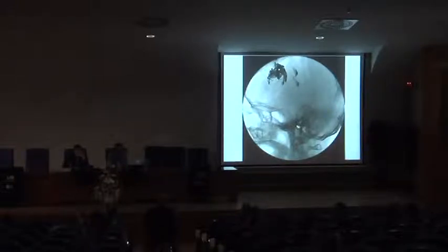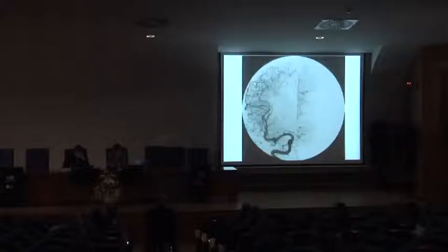Second, quick change of hemodynamics. And third, we push liquid polymer into a possibly ruptured aneurysm during injection of liquid polymer. This is a happy end. You can see the malformation is not open. You can see 3 months later this malformation has disappeared, with a very good result.